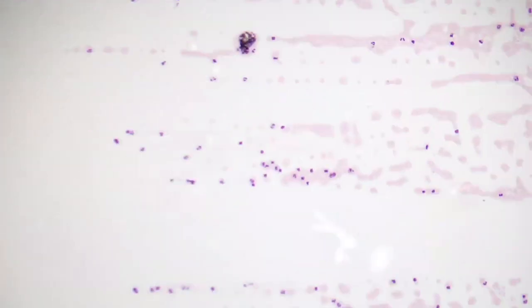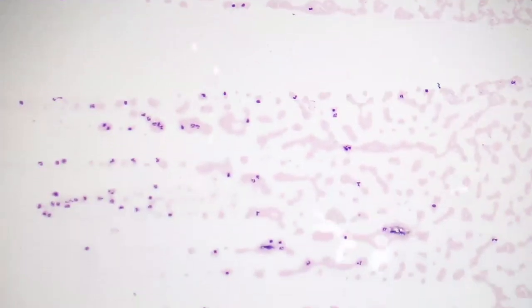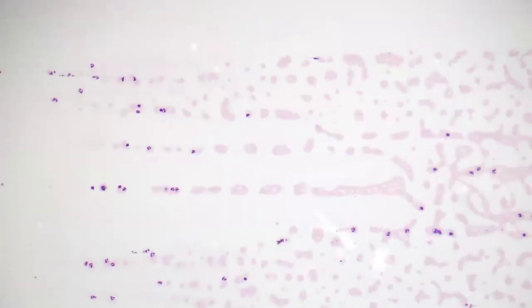So next we're going to talk about iron deficiency anemia. We'll start, as we do with every blood smear, by looking at the feathered edge to make sure that we don't miss something out here that we wouldn't see in the zonal morphology. After you scan the feathered edge and determine that there's not really anything that you're going to miss, we find our zonal morphology again by going two 10x fields in.